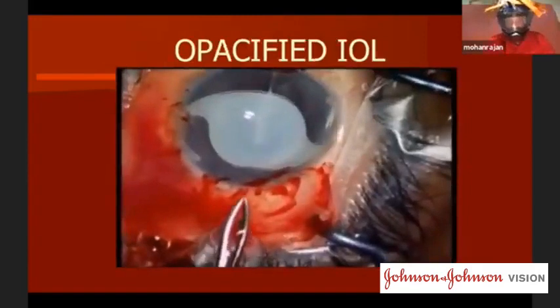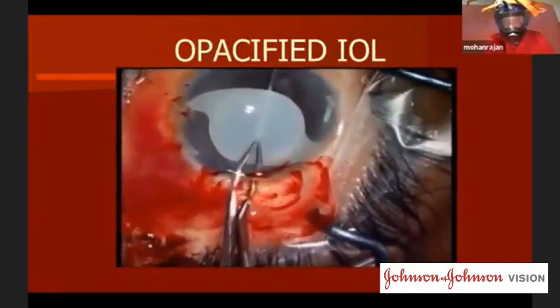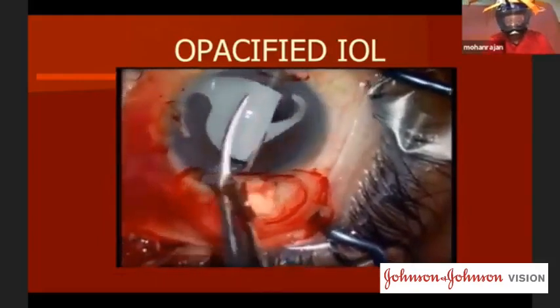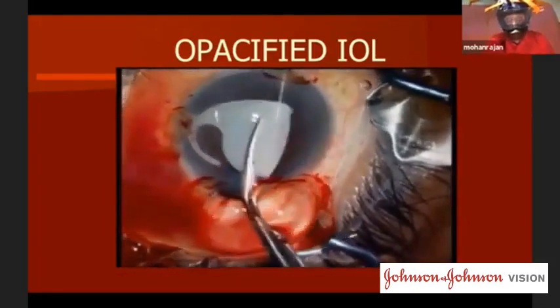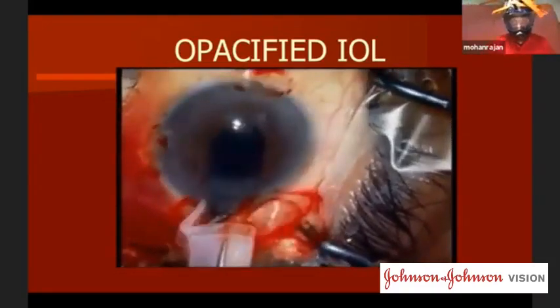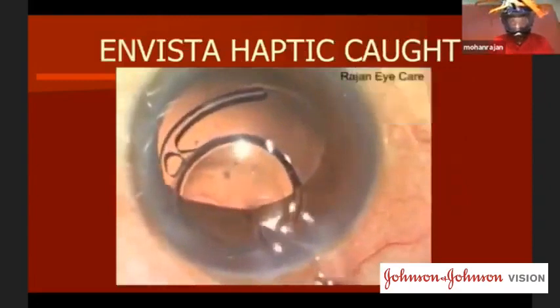One of my optometrists came and told me, sir, there's a patient with a recurrent mature cataract, and there's nothing but an opacified IOL. You can see this opacified IOL, hydrophilic lenses, which we reported way back in 2002 in the AIOS as well.